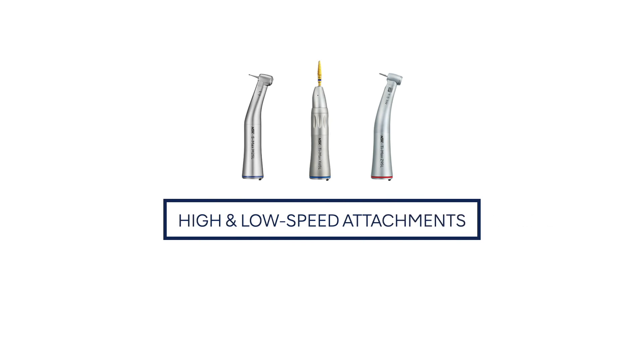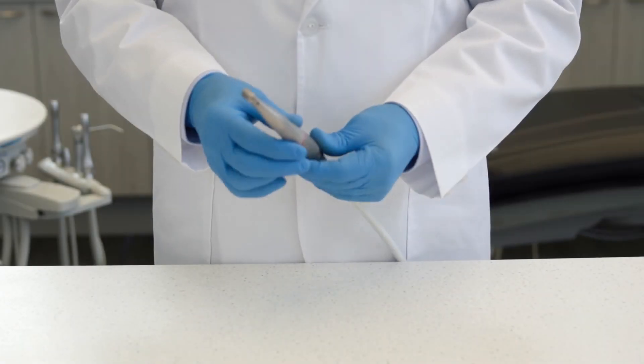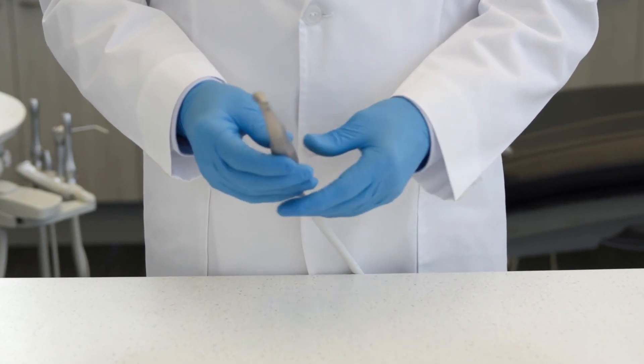Reprocessing instructions for NSK high and low-speed electric attachments. In this video, we'll use a Z95L high-speed attachment.